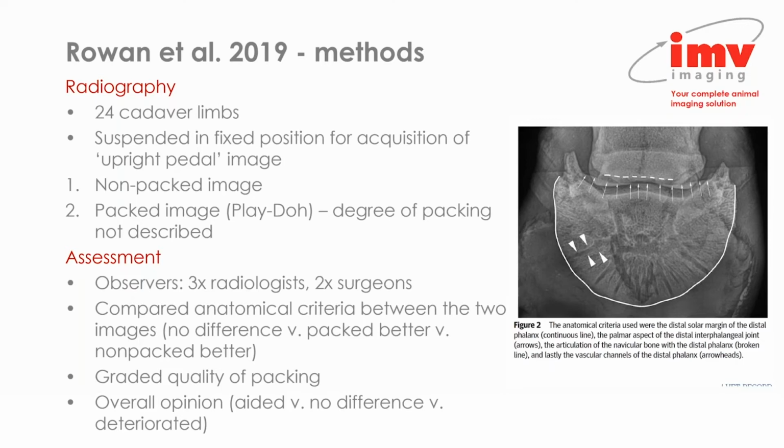So each of the images was acquired in exactly the same angle, and so they accounted for that potential confounding factor of different angles, which was great. Firstly, they acquired an image that was non-packed, so the sulci were not packed. And secondly, they packed the sulci with Play-Doh.